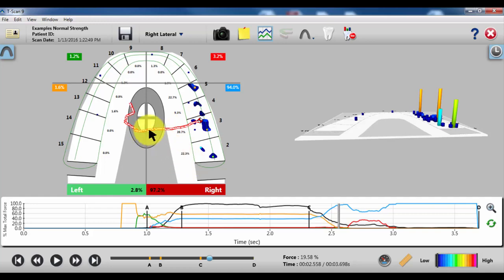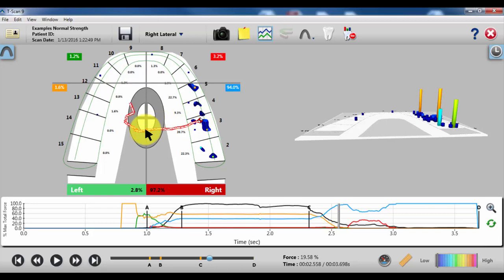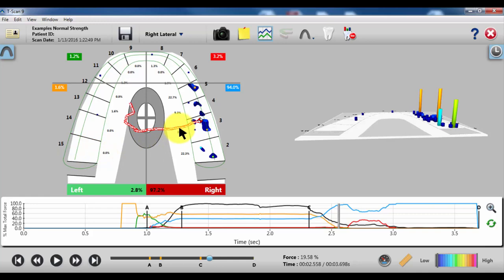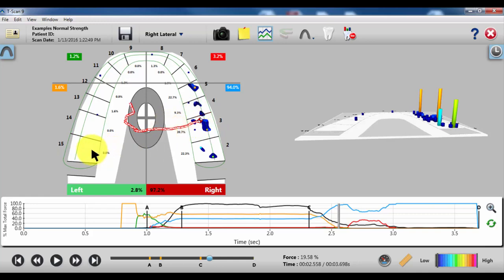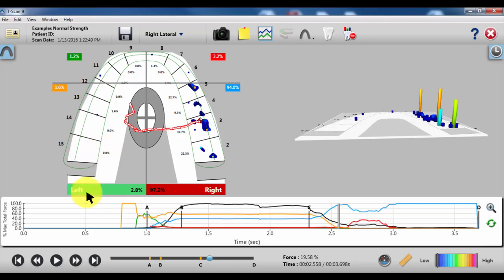If this red line came posterior, we would have some confidence that somewhere on 2 is dominating it. But another way this tool helps us is if there's a balancing side interference. If there was a contact during this excursion on tooth 15, you'll tend to see the red line start to turn backwards or start to make little knots. That would be a clear way to indicate there's some interferences going on the balancing side, and then you can have a quick adjustment on it.